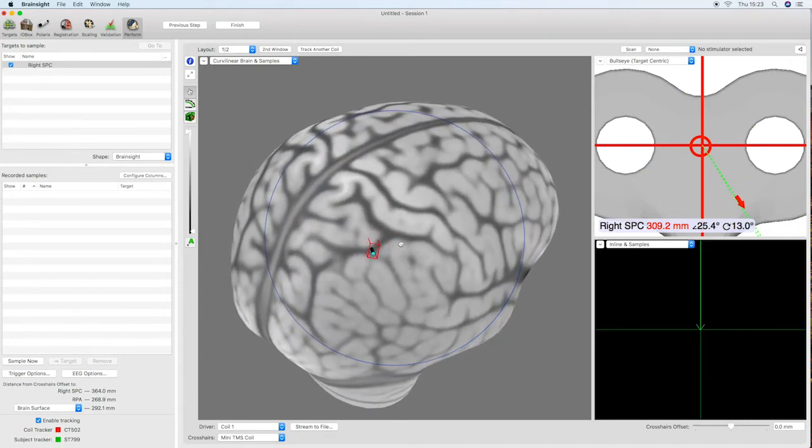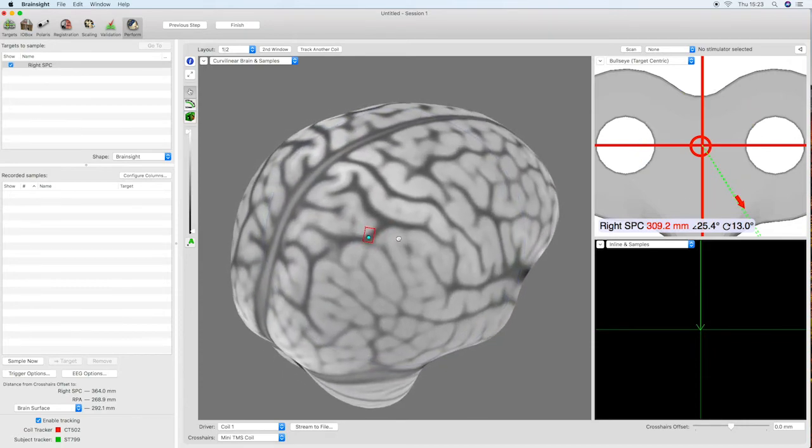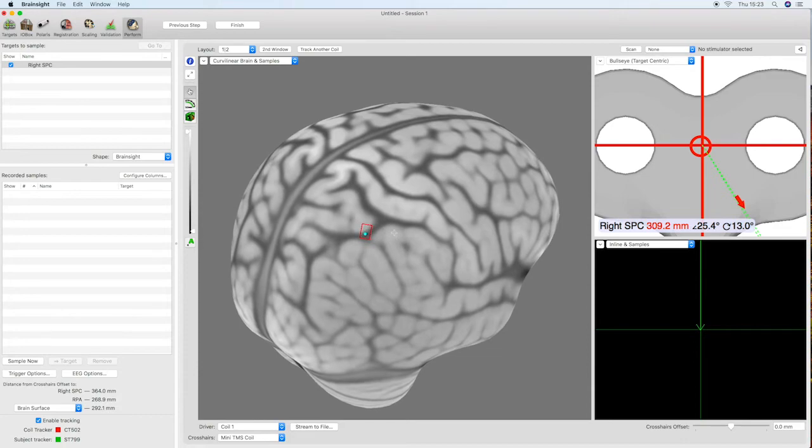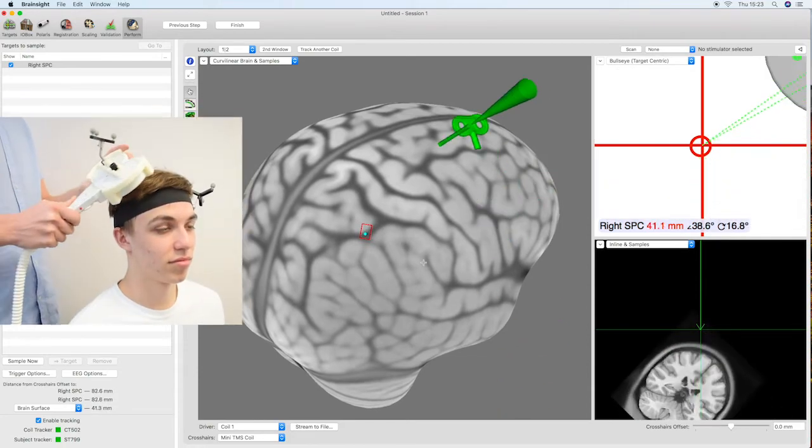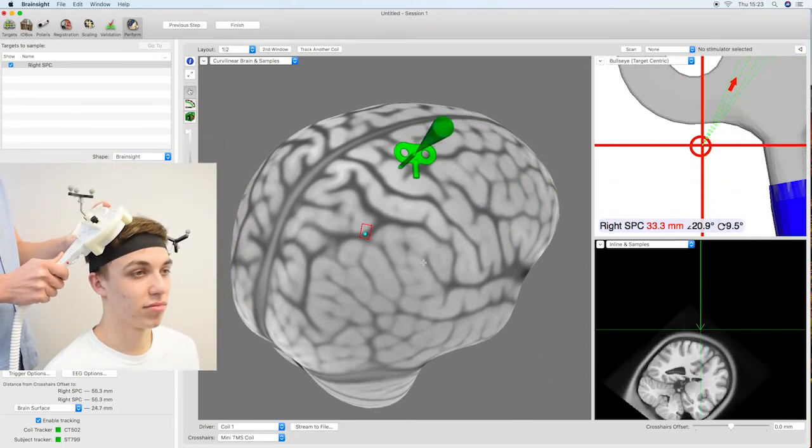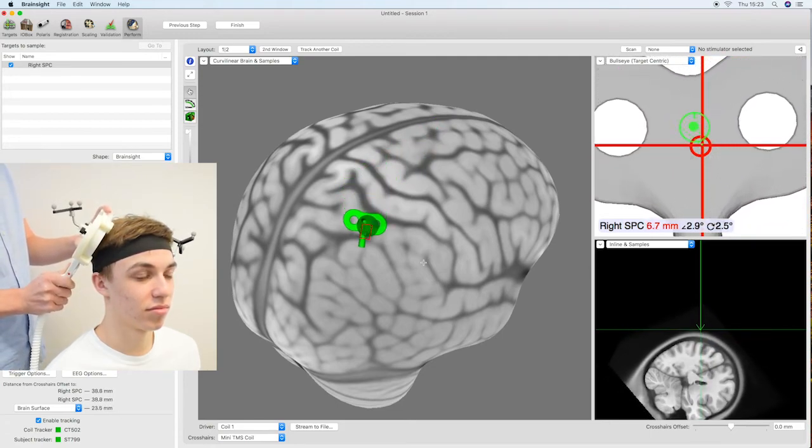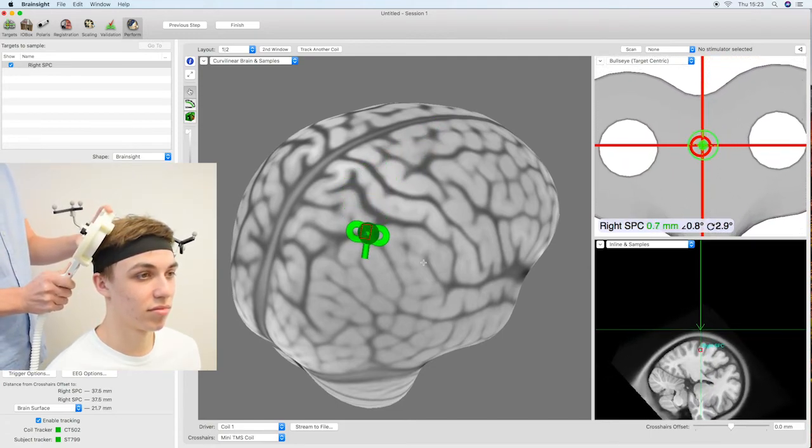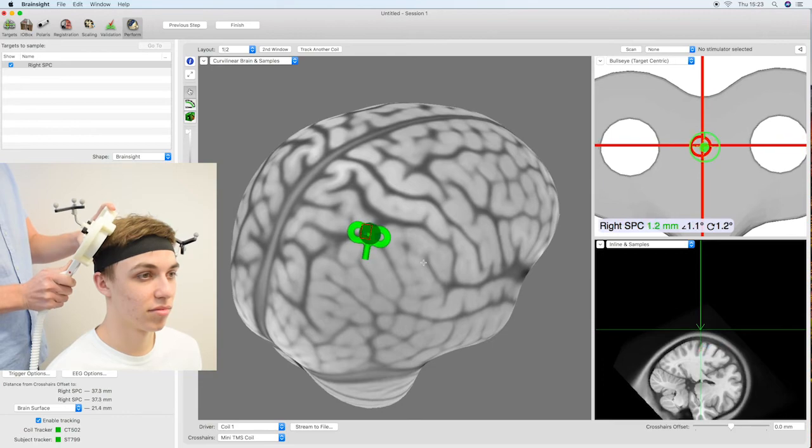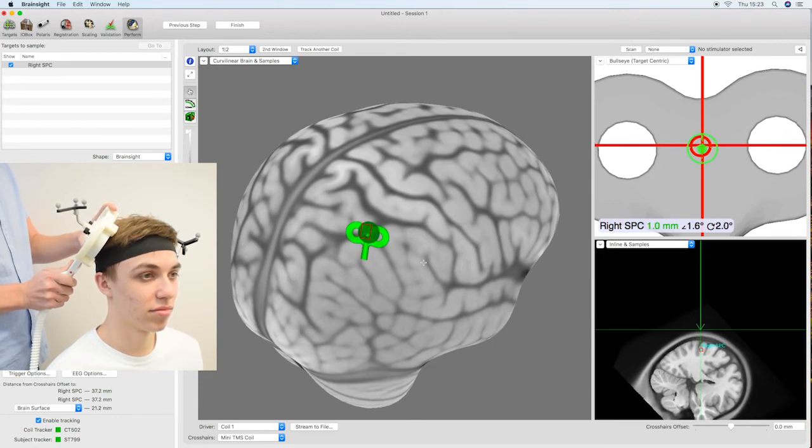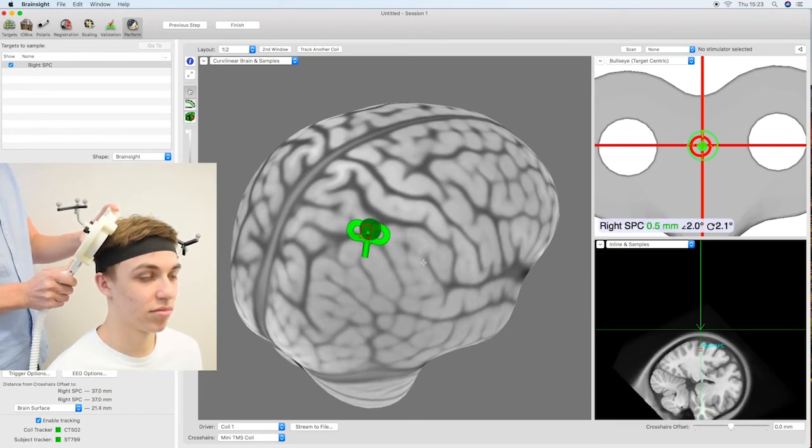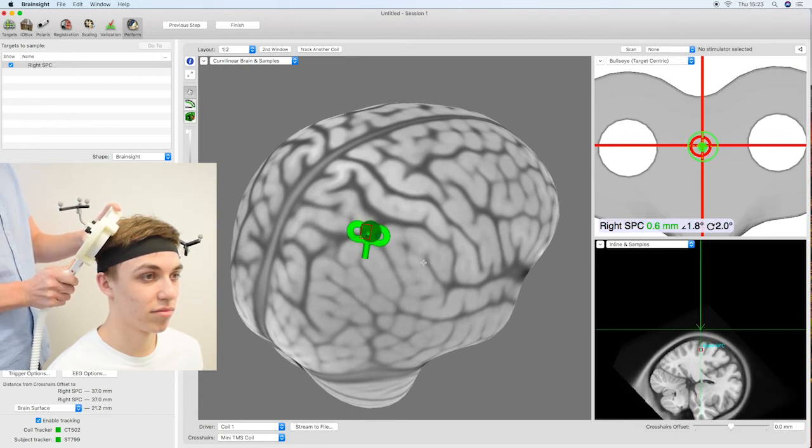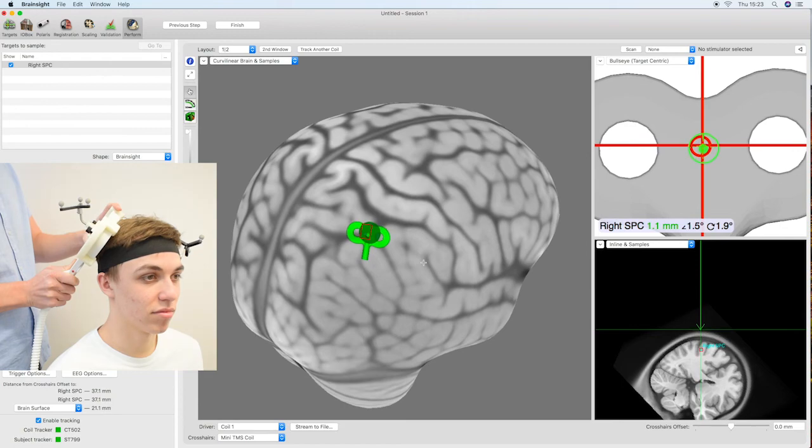The bullseye view can be used together with other 2D and 3D view options within Brainsight to guide you to the correct location and correct orientation for this target. The curve linear option is often very useful, especially when oriented in line with the target trajectory as in this example. In this case both the dot and the circle should align to the cross in the bullseye view in order for the coil to match the predefined trajectory.